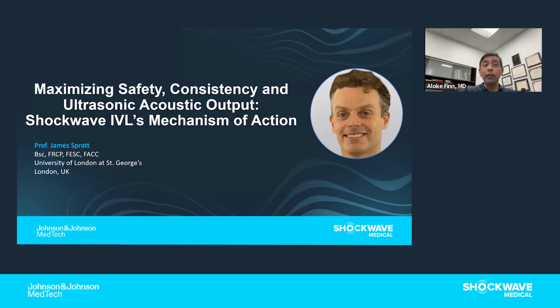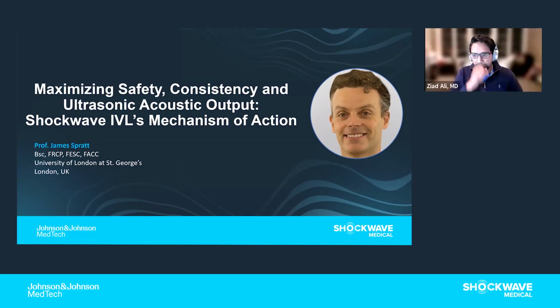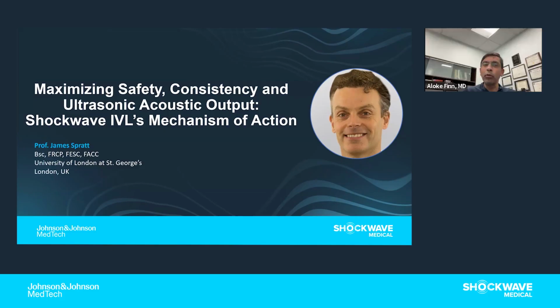I do, yet I still think we don't really know. The problem is when we see a restenosis case, we've put a stent in, we really don't know whether there was medial injury. So we don't know the factors that went into causing that restenosis. So I think we tend to underestimate in the clinic that technique and not injuring the vessel too exuberantly really does matter in terms of outcomes. We just don't have the technologies to tell us how much medial injury we actually did when we implant the stent. But it's certainly easy to do it.